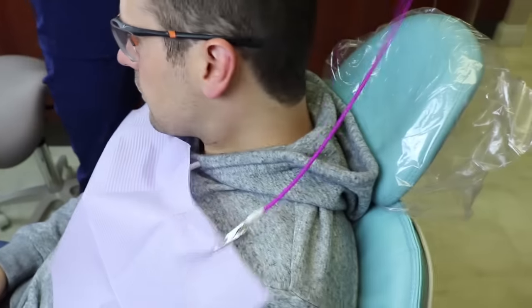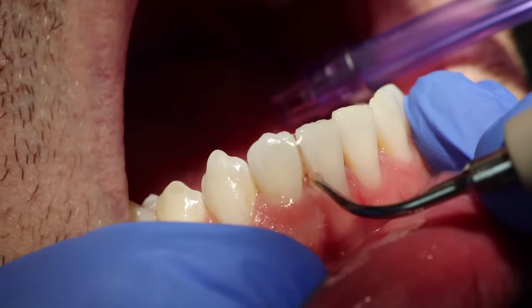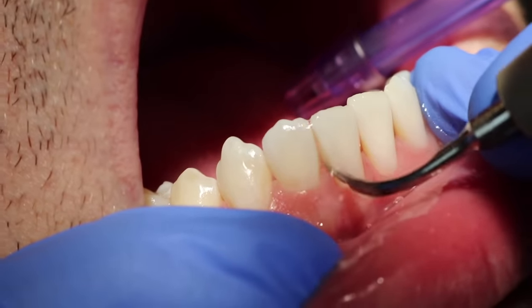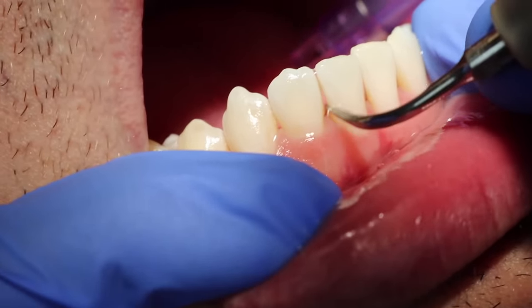Today's video will show you a routine dental cleaning with a close-up view of the mouth, specifically removing the tartar, plaque, and stain. I'm starting right now with the ultrasonic scaler, which I use on every single patient.